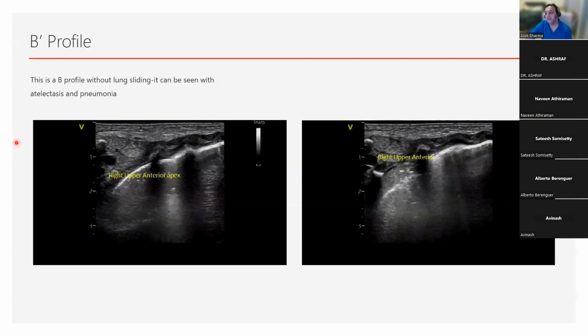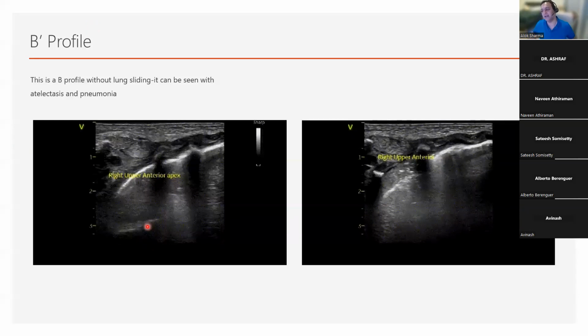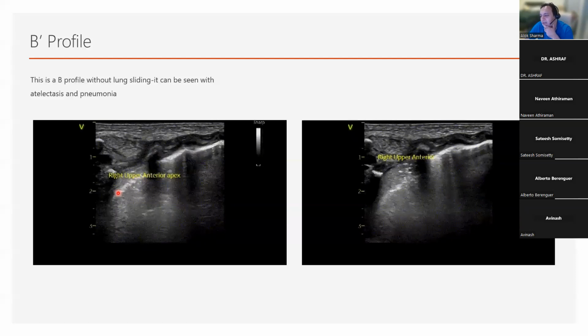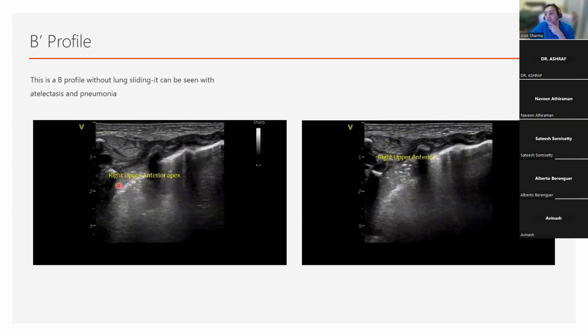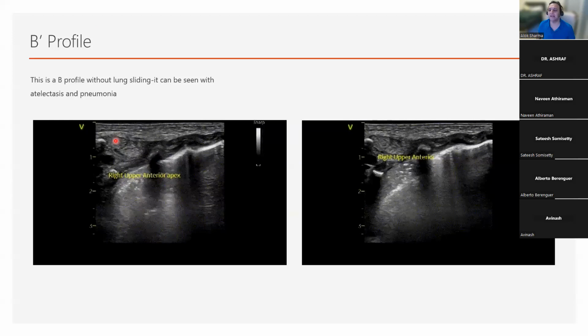Okay. So this is the same baby who was intubated in the right main bronchus, and we had complete atelectasis. Now we've pulled the tube back and there is some aeration. So when the ventilator gives its inspiratory phase, air enters and the pleural line is established. But in the expiratory phase, we still haven't recruited the entire lung. So actually, what you're seeing is slight improvement. You can also see that there are fewer static air bronchograms at this particular point because the lung is starting to re-expand.